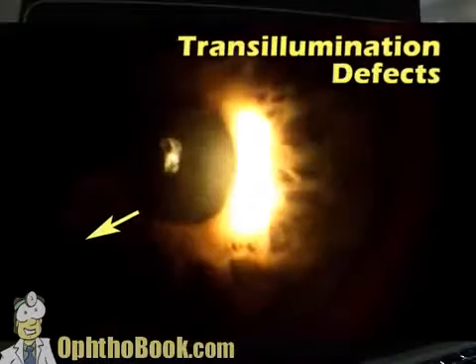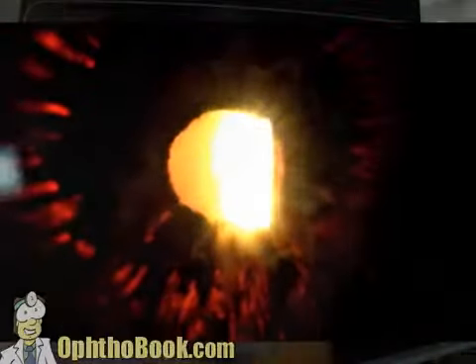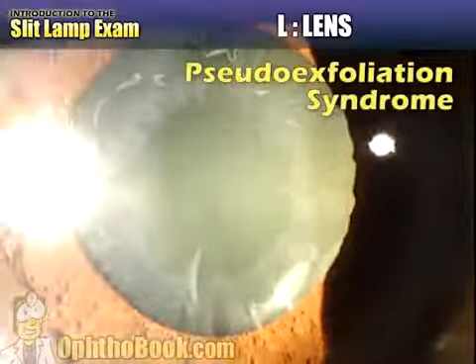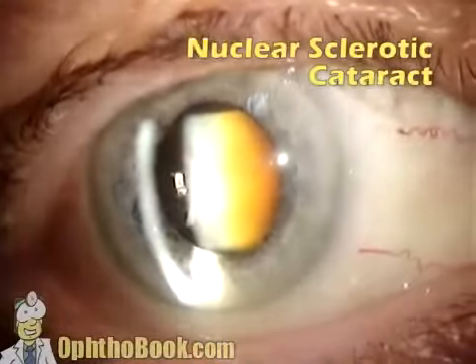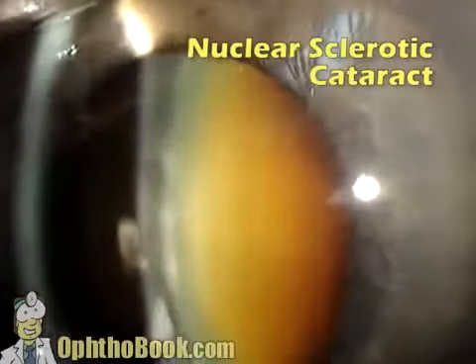You see it with pigment dispersion syndrome. You can also see something very similar to this with pseudoexfoliation, where you have this dandruff-like material that forms on the surface of the lens, and as the iris constricts and dilates, it rubs off that pigment, and you can see these findings. Our standard cataract, a 3 to 4 plus nuclear sclerotic, very yellow, very brunescent.